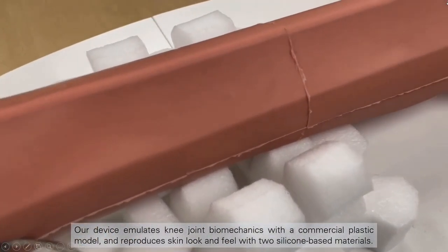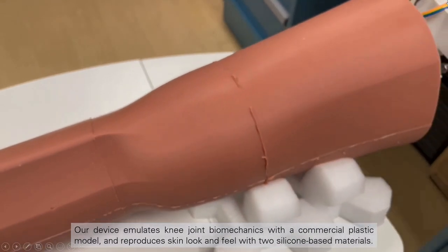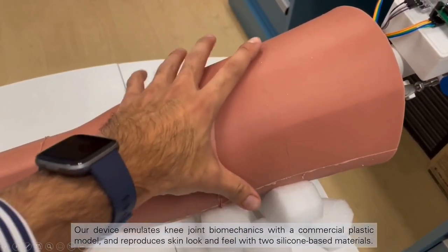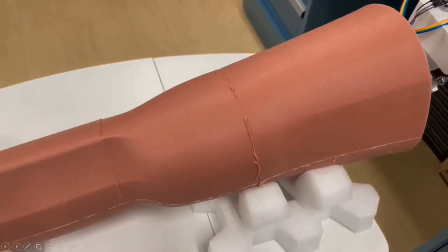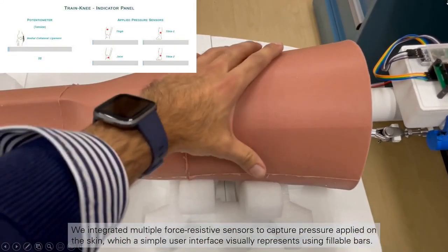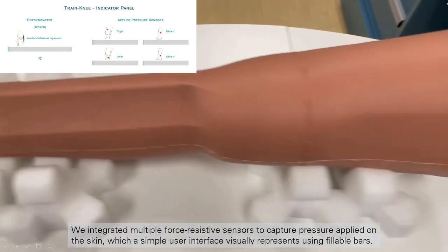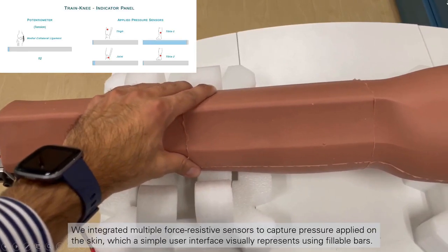Our device emulates knee joint biomechanics with a commercial plastic model and reproduces skin look and feel with two silicone-based materials. We integrated multiple force-resistive sensors to capture pressure applied on the skin, which a simple user interface visually represents using fillable bars.